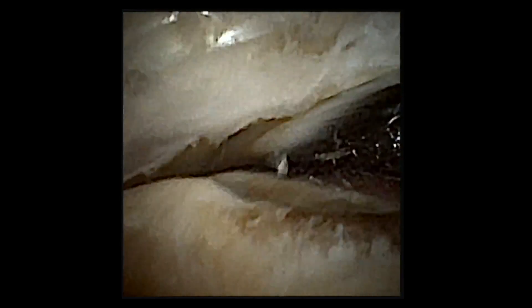Now let's demonstrate the shaver. You'd think that having a 2mm to 2.8mm shaver we'd lack power, but the way they've made this — they've increased the sharpness — and this thing can really get in for a subtalar fusion. I have not done an open subtalar fusion since leaving fellowship; I've been doing them all arthroscopically. This is the subtalar arthroscopic arthrodesis, and this little shaver — don't underestimate it because it can really get in and get tissue gone, and this is just in a couple of seconds.